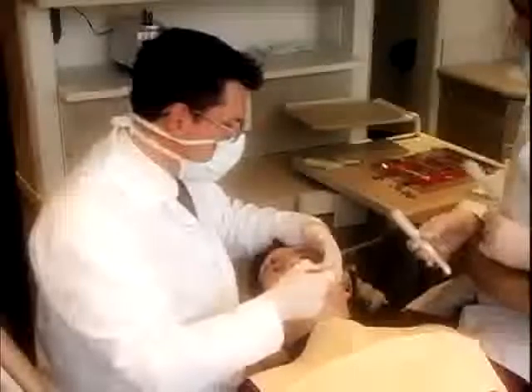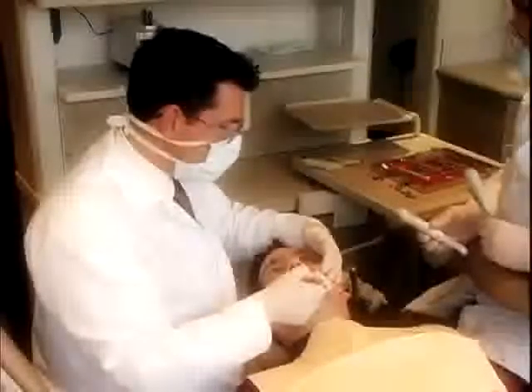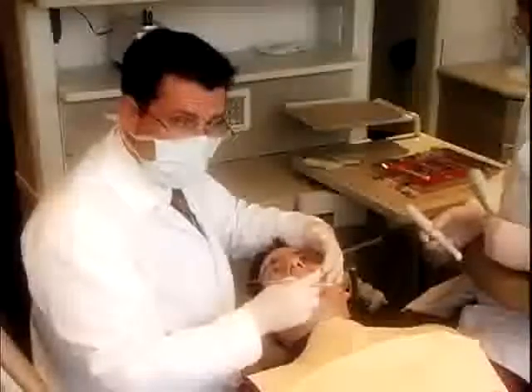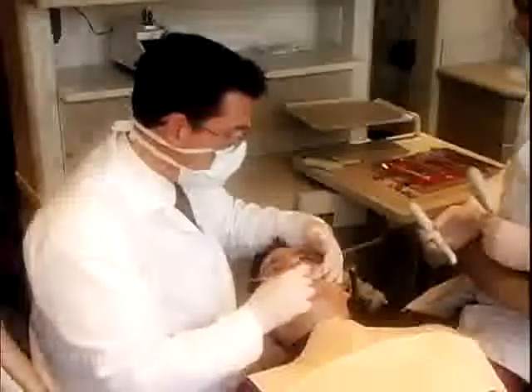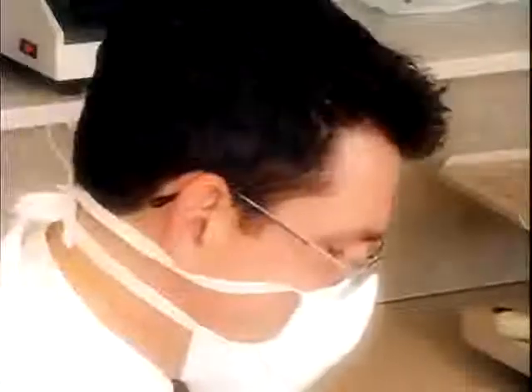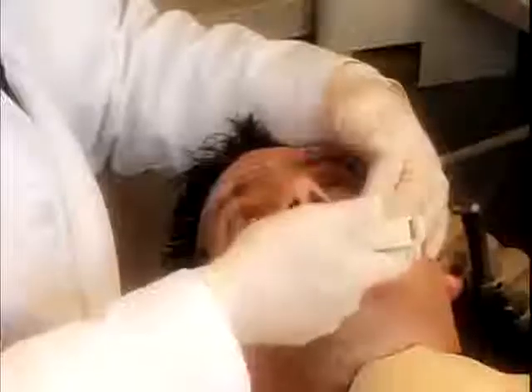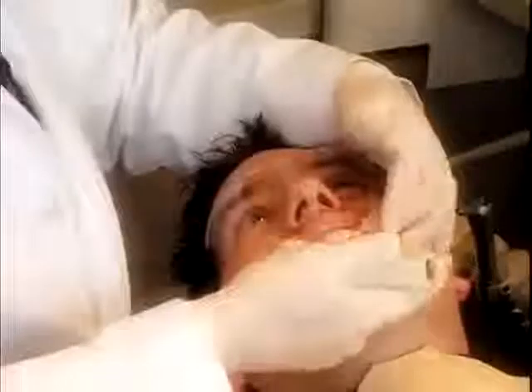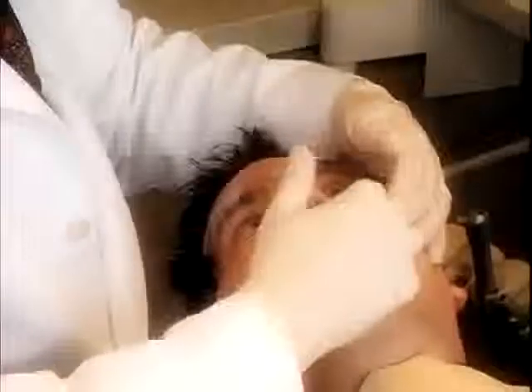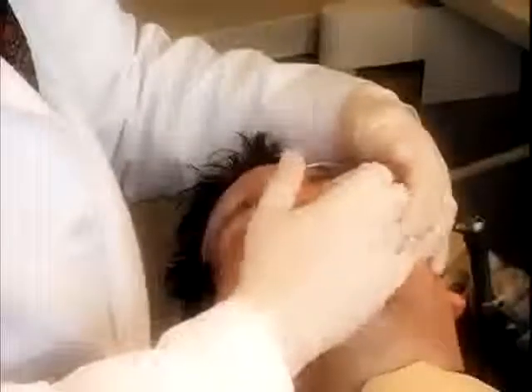Our plan for Randy is to use Lumineers. Lumineers are a non-invasive way of creating cosmetics, which means we don't have to drill on tooth structure to accomplish Randy's goals. For those of you concerned about injections, it's also a method of approaching cosmetic dentistry without injections. Lumineers typically take 2 appointments. On the first appointment, we take impressions, and on the second appointment, we bond the final restorations in place. The simulation provides a guideline for us to understand where we would like to go with the final tooth shape and length.